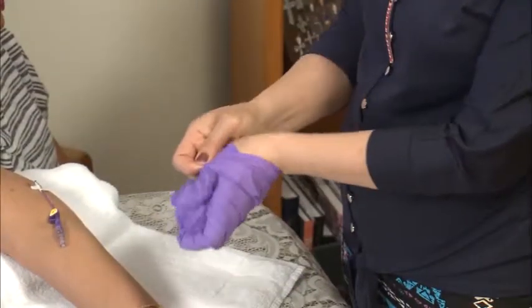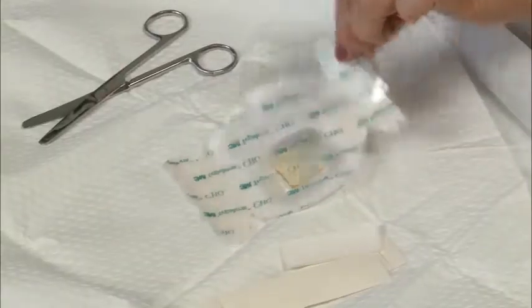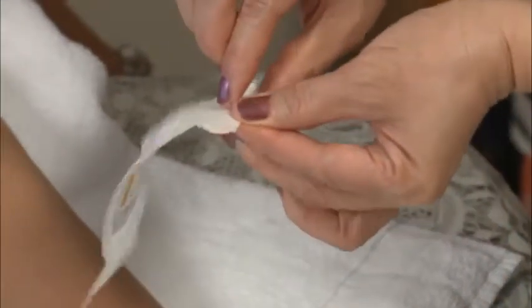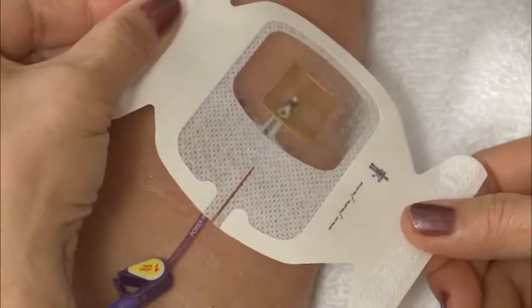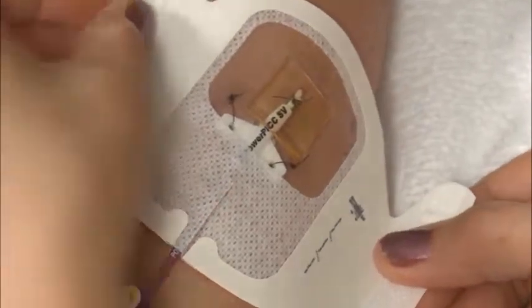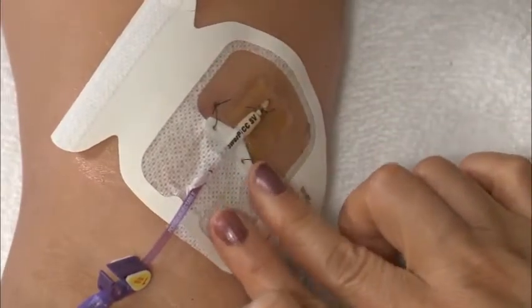For the transparent dressing, remove and discard your sterile gloves. Pick up the clear dressing. Peel the plastic backing off. Hold the edges of the dressing. Center the antiseptic gel pad over the insertion site. Center the V cutout over the extension. Do not stretch the dressing or it will pull on the skin. Press the dressing down onto the skin, starting at the center, and then move outward toward the edges.